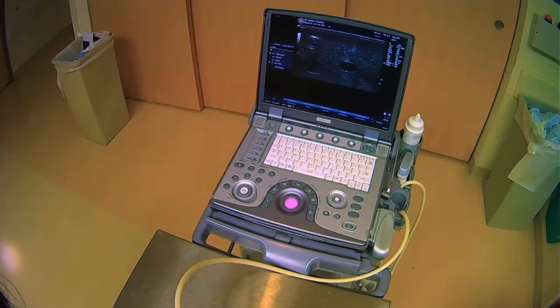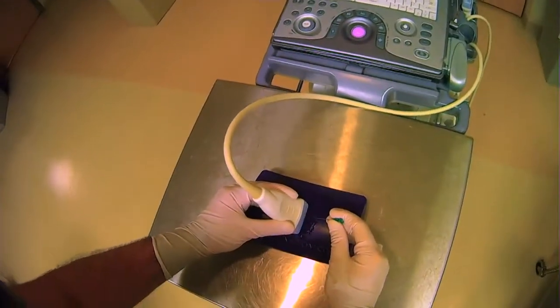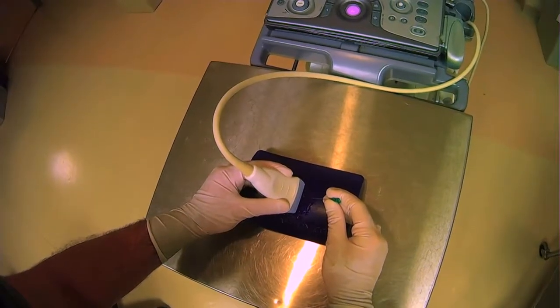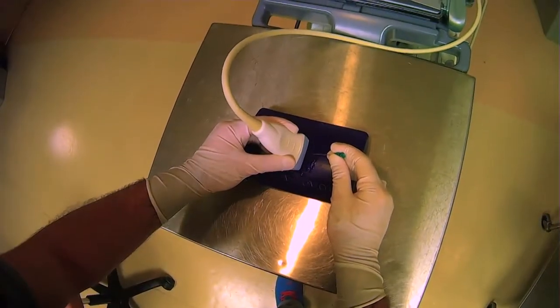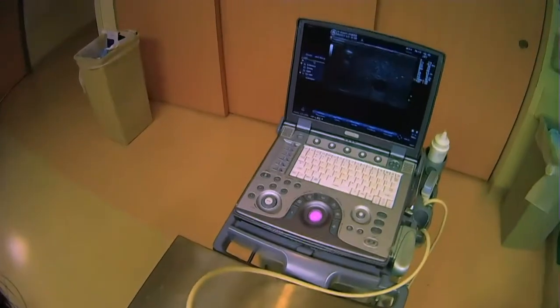So as we go deeper, we can see the tip of the needle because I've obliqued, but as my right hand drives the needle deeper I have to steepen my angle with this probe to follow that tip.